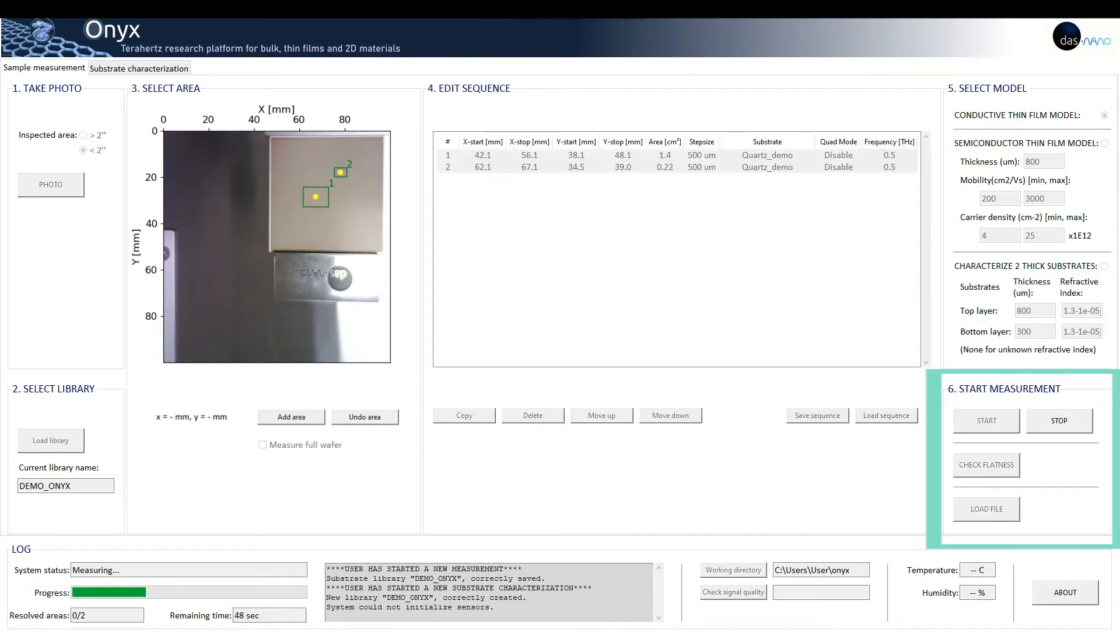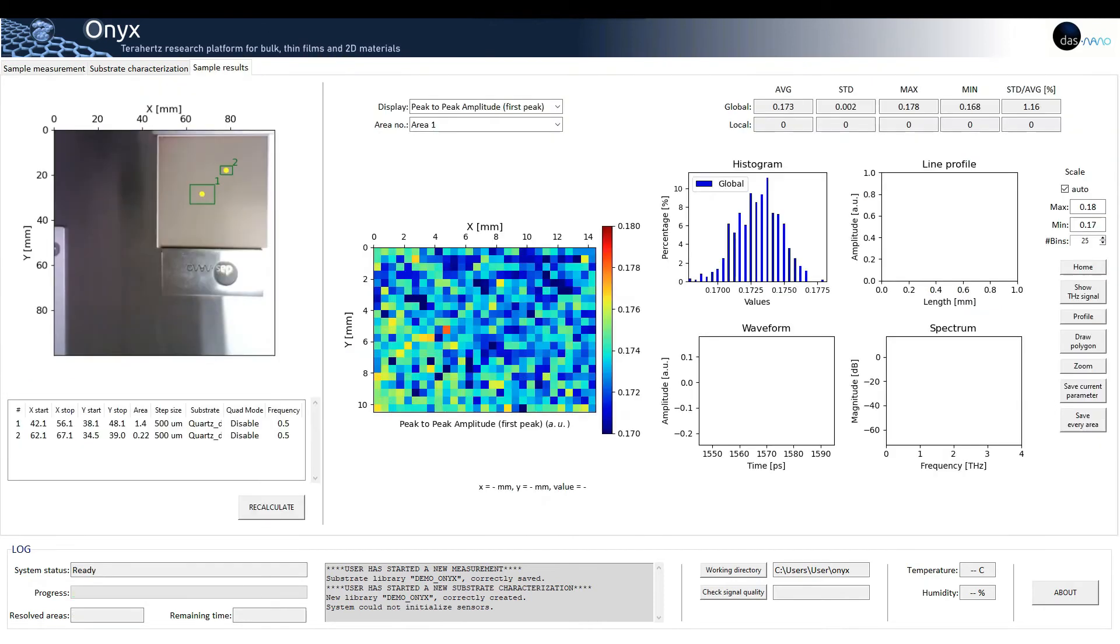We click the start measurement and wait for the results to appear. The log section gives approximate measurement and processing time information. Once the processing is completed, the sample results tab appears.